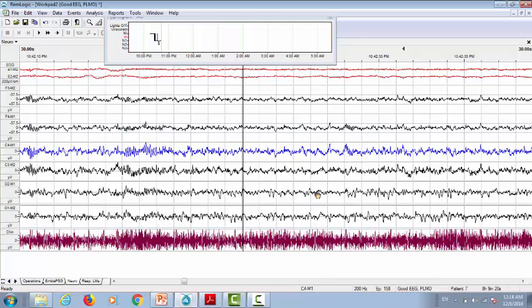So when you score N1, you divide the epochs into two halves. You look at the second half. If there is an indication of N2 for the next epoch, then we keep it in mind and we go forward and we score the epoch accordingly. Here we don't have any indication or sleep signature for N2, so this epoch is N1, and the next epoch is N1 unless there is an indication for scoring N2 in the first half of the next epoch.